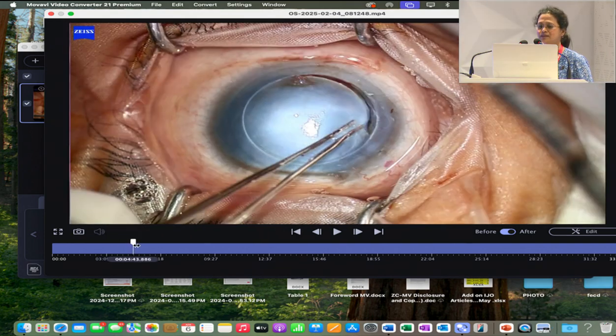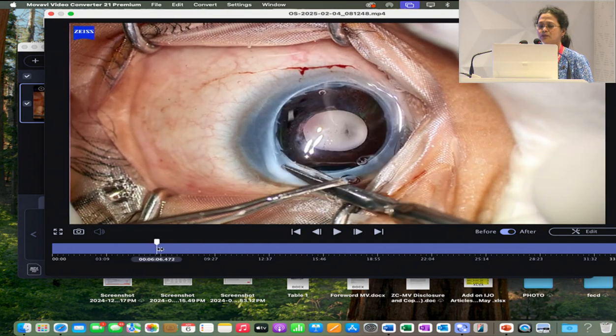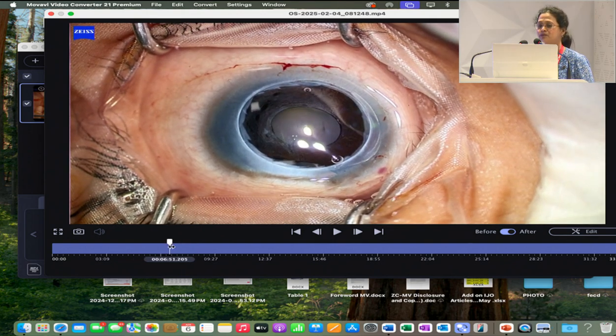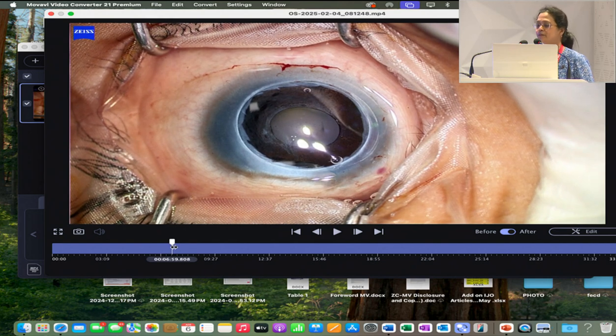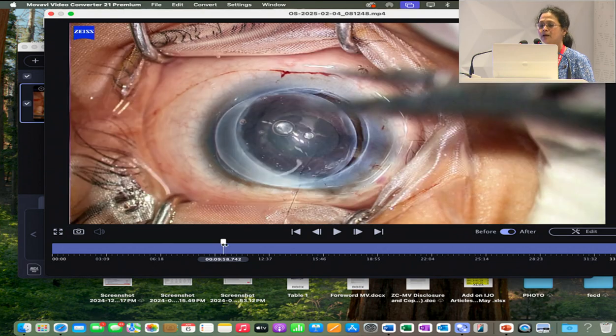So here you've got a suction trephine. You've trephined it here, and I would still like to do it without the posterior ledge, but I do land up getting a posterior ledge. Once you've opened up, you see the iris is anomalous, and the pupillary margins are also anomalous, but the angle recesses are pretty much okay in these cases.